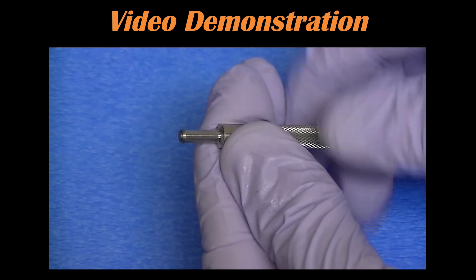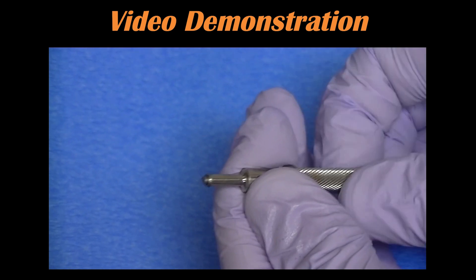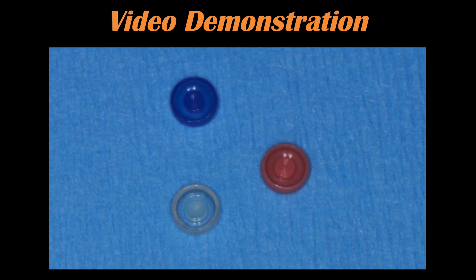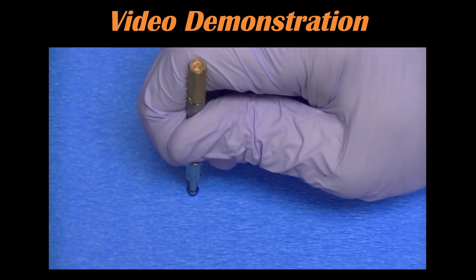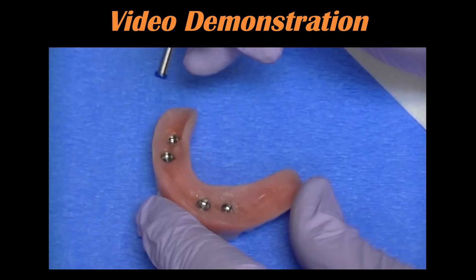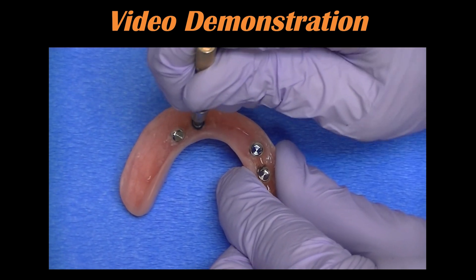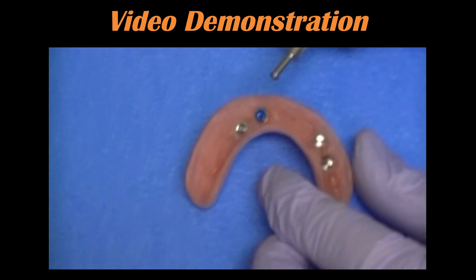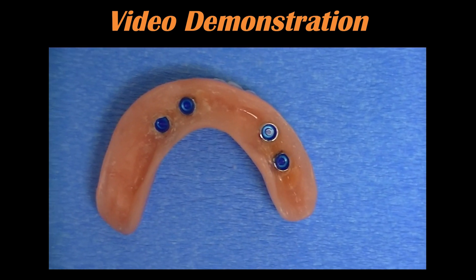As I like to do, I go with the lower retentive attachment first, knowing that when the patient comes back and is feeling more comfortable with the appliance, I will change it over to the next heavier retentive attachment as necessary. I'm simply snapping into the attachment, going right to the receptacle — it'll just snap right in. I turn one end to release it, and I know that attachment is in the correct, ideal position.